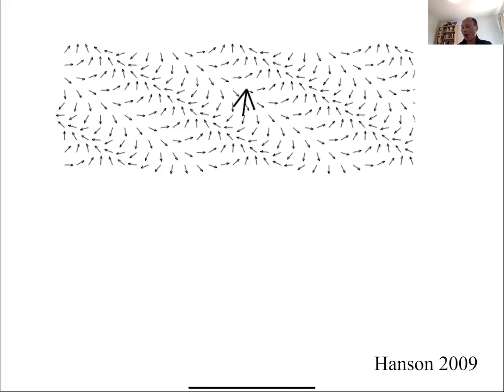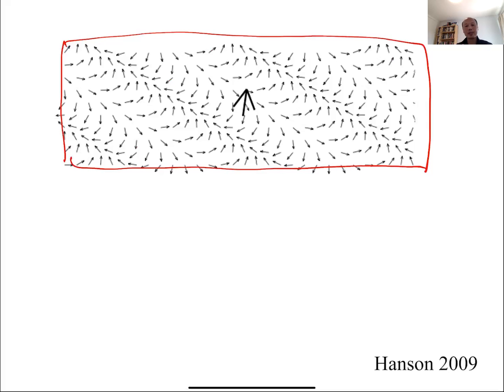So this is an example showing you why it matters, how the spins and the integration work together to give you the value of k-space. So imagine you had a uniform object, maybe like a bar of chocolate, with spins in it. The multiplication isn't like we have a multiplier in the object, but basically wherever there are hydrogen protons, the multiplication comes from using the gradients to orient the spins such that they have the right spatial pattern.